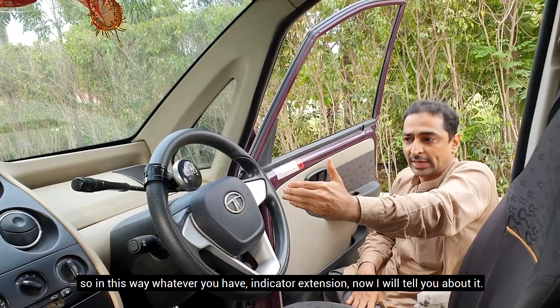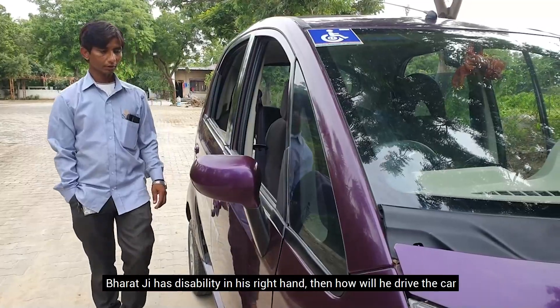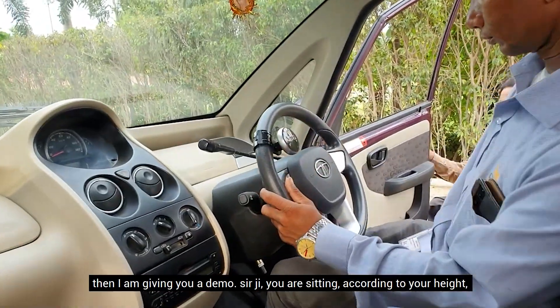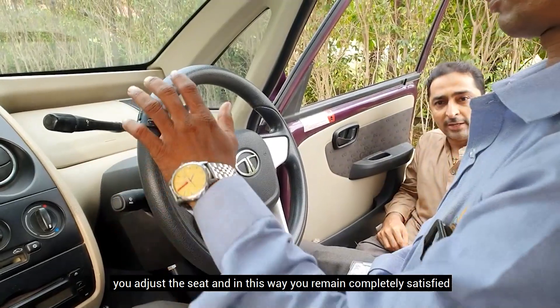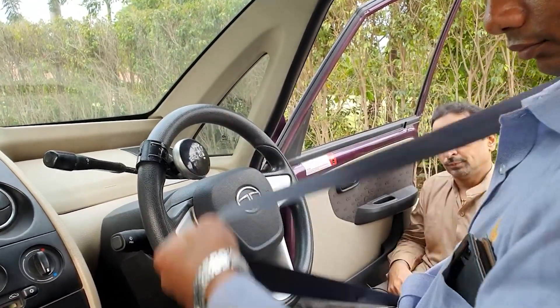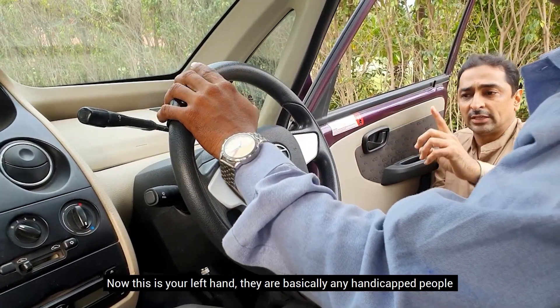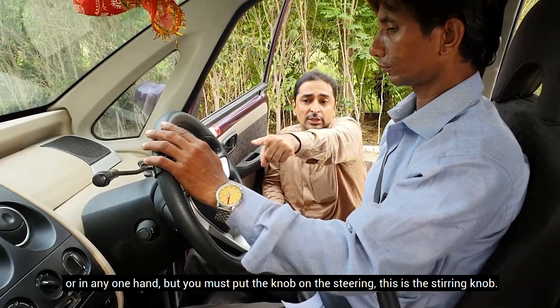This is the Indicator Extension. Now I am giving you a live demo. Bharat Ji, come on. Bharat Ji, right hand disability — I am showing you how the car will be driven. Bharat Ji, sit down, adjust your height and the seat, and make yourself completely comfortable. Then you will use the safety belt. You will wear the safety belt and use your left hand on the steering knob.